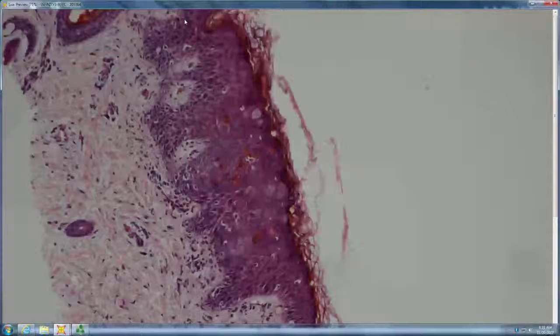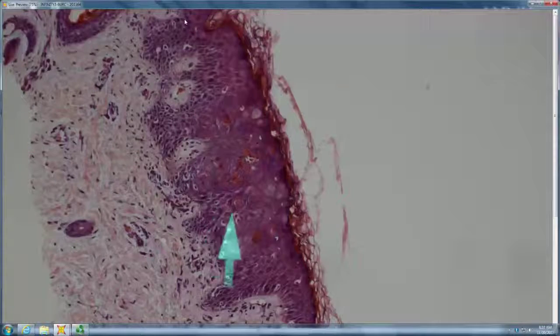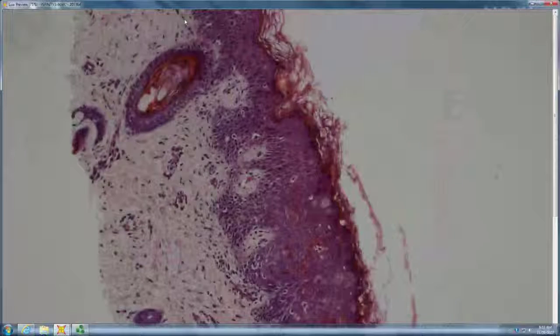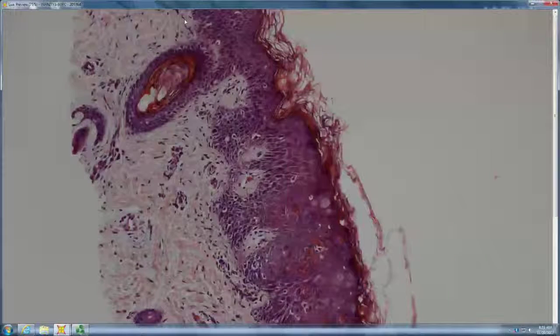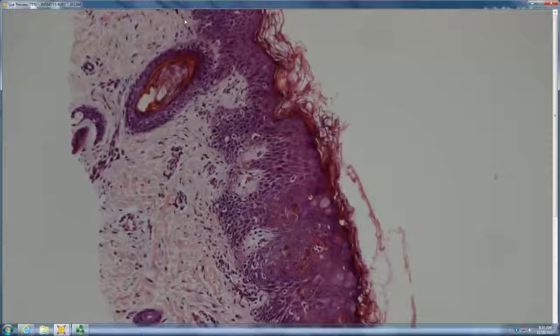So there is a disorder in the epidermis with very many red dyskeratotic cells, and this is the verruciform stage of incontinentia pigmenti. Very good. So pass that easy button over. So this one is the verruca stage of IP.